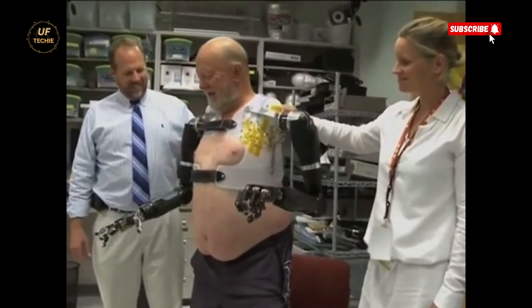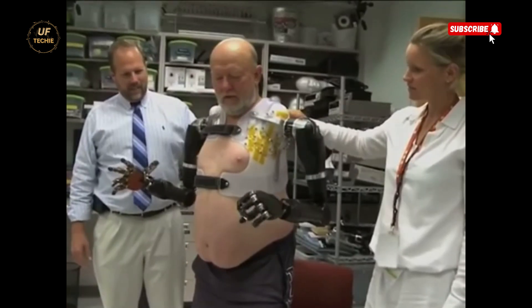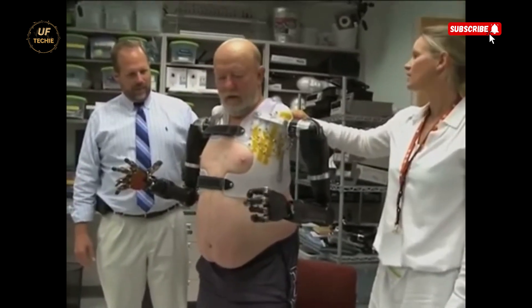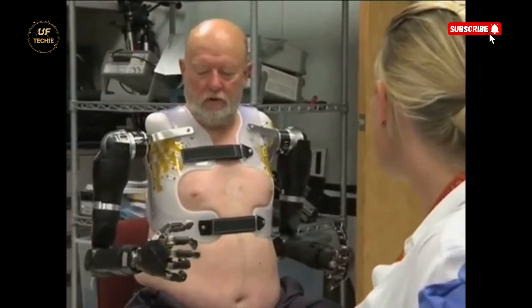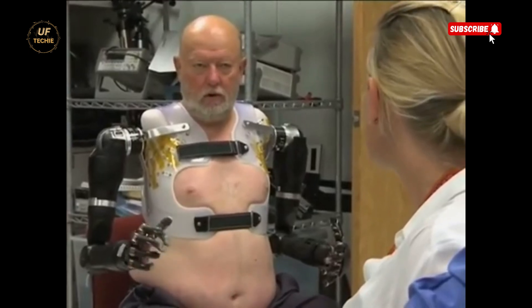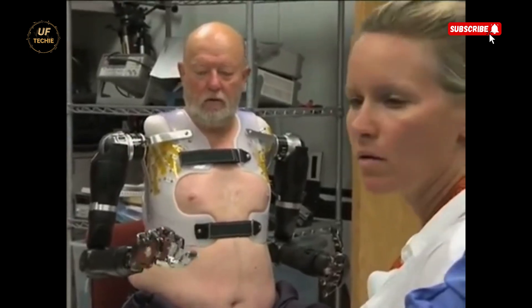When asked how it felt, Leslie said that once the system was active and he was in control, he entered a completely different world — one filled with possibilities. The arms responded to his thoughts in real time, allowing him to perform complex movements like grasping, rotating the wrist, or bending the elbow. He was able to access multiple degrees of motion: shoulder, elbow, wrist, hand, and fingers.